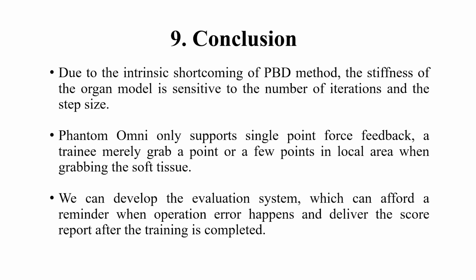Nevertheless, there are certain limitations in our simulation. Due to the intrinsic shortcoming of PBD method, the stiffness of the organ model is sensitive to the number of iterations and the step size. But it could be eliminated with extended position-based dynamics, XPBD, which can be employed in our simulator in the near future. At present, Phantom Omni only supports single-point force feedback. A trainee can merely grab a point or a few points in local area when grabbing the soft tissue. To achieve more realistic results, we need to improve the haptic device to achieve multi-point contact.